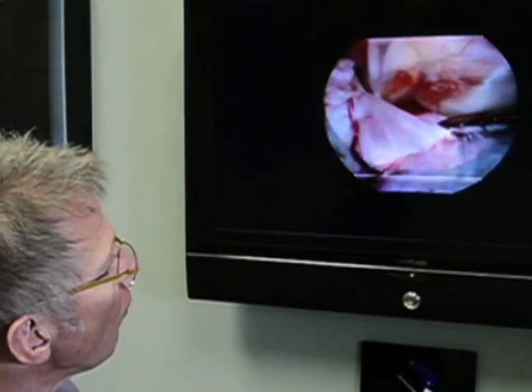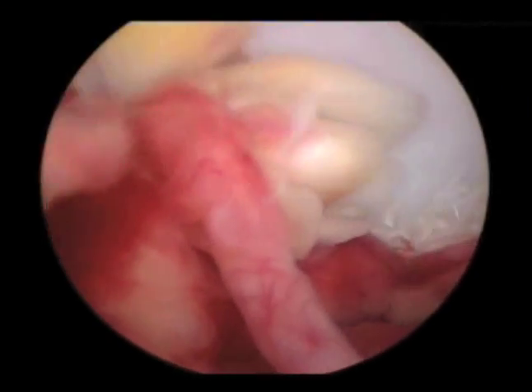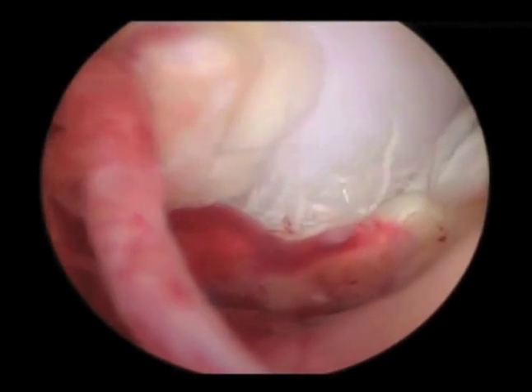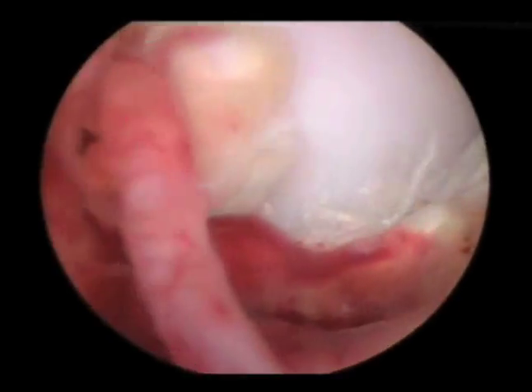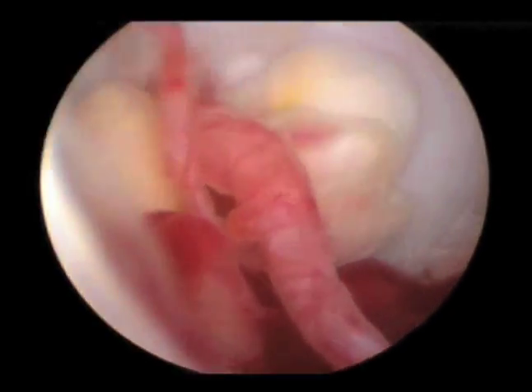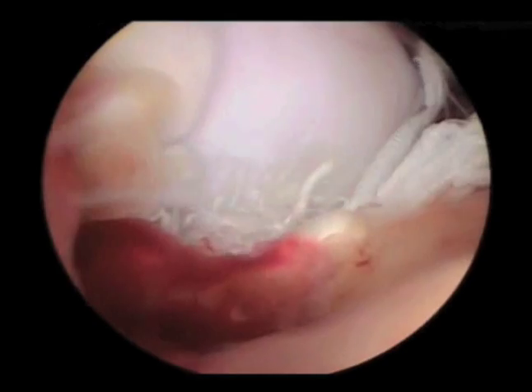Next, we'll look at one that is torn, and here we see the ligament that has pulled apart, almost like a mop head being pulled apart, with large and small fibers, with hemorrhage within the joint, and this represents a full, complete ACL tear. Once we've made a definitive diagnosis, then we move ahead with the Tibial Plateau Leveling Osteotomy, or TPLO. And I'm going to walk through that with you step by step.